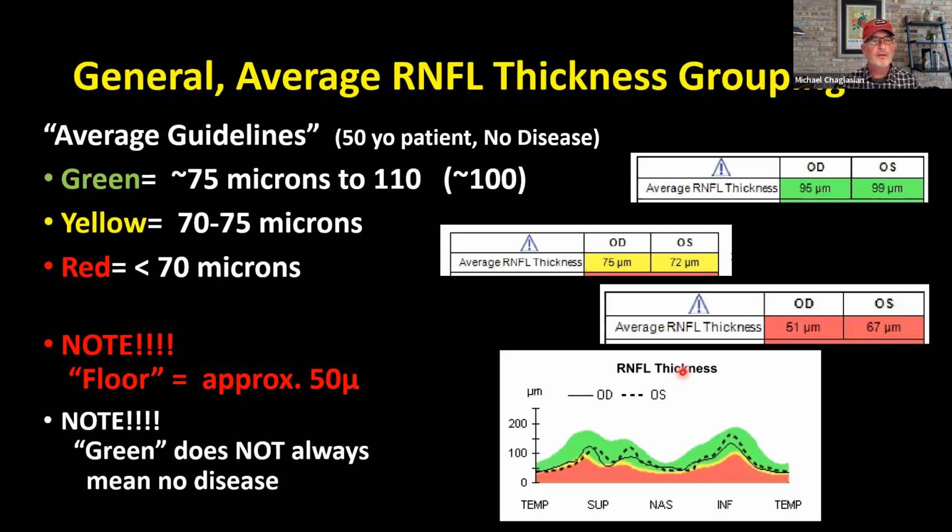So here is just another slide reiterating those guidelines and the normal ranges within the reference database. They're not exactly the same between all devices, but generally quite similar.